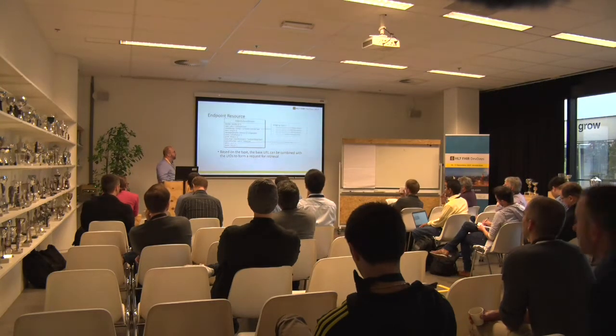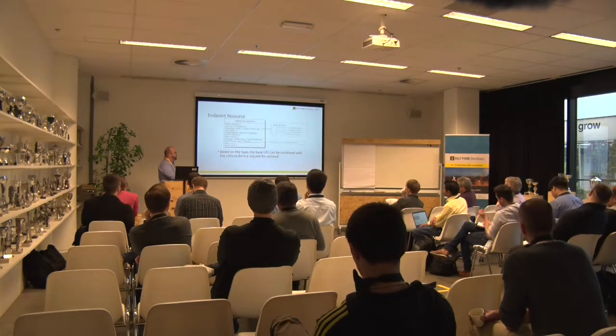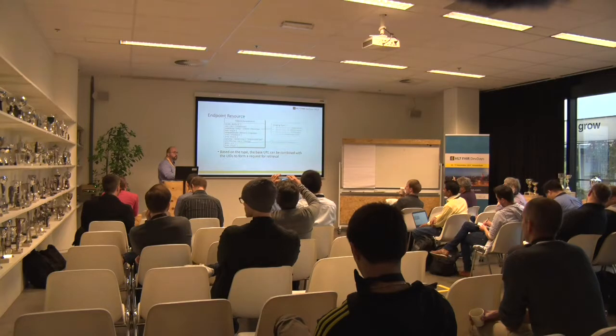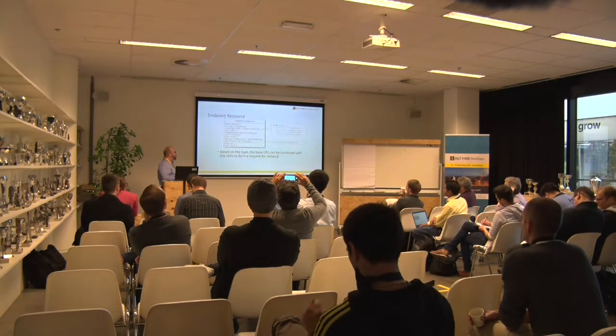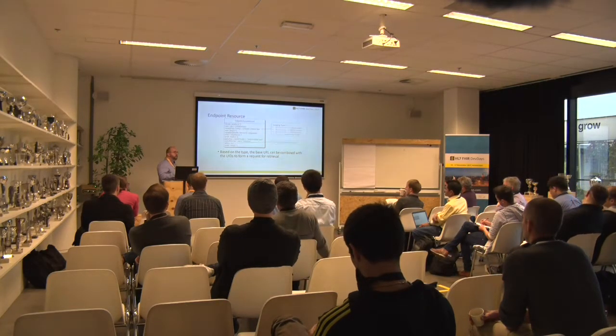WADO URI, which is the classic or legacy WADO retrieve, which is what most systems support today. WADO RS is the RESTful interface to this. QIDO is a way to query to get more detail about these objects. And we also have IID, which is a profile that IHE describes that allows you to launch a zero-footprint viewer to visualize those images.